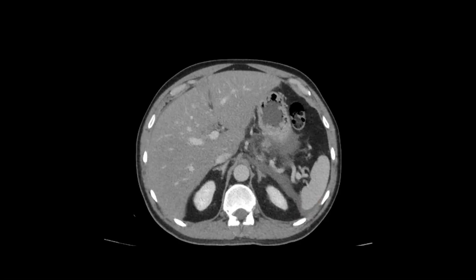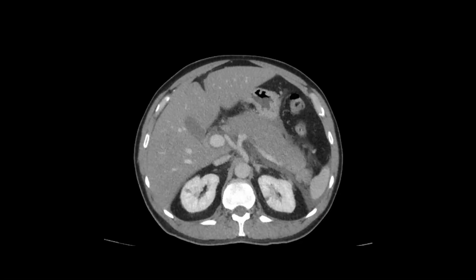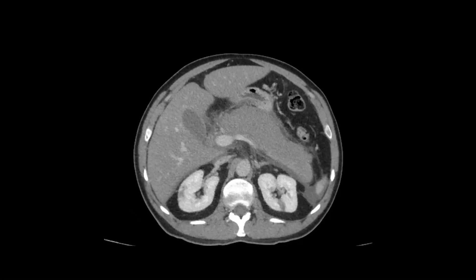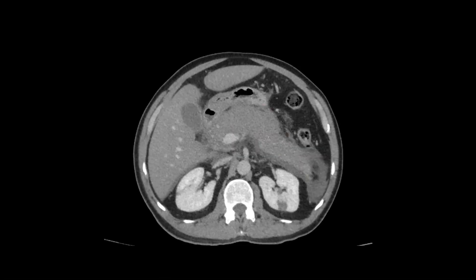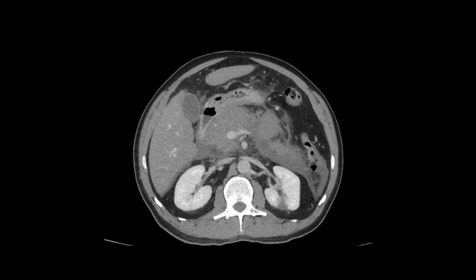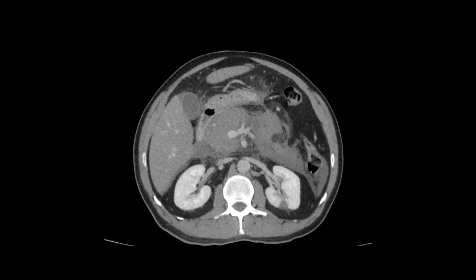As we scroll inferiorly, you can see that this is due to an enlarged, edematous pancreatic body and tail, which is markedly hypoenhancing. There's also quite a bit of peripancreatic edema and stranding.